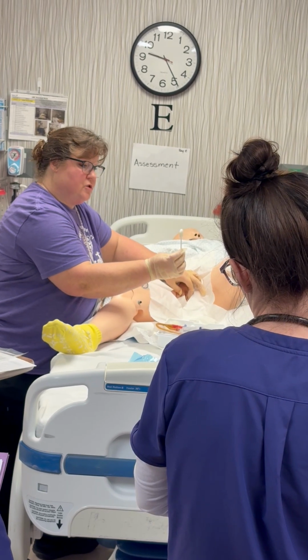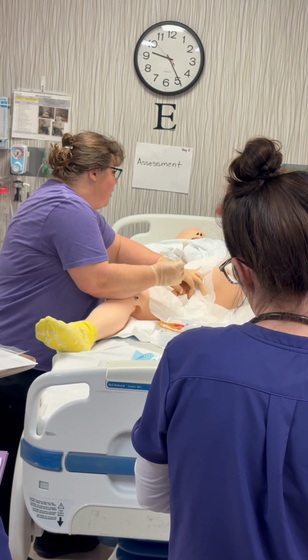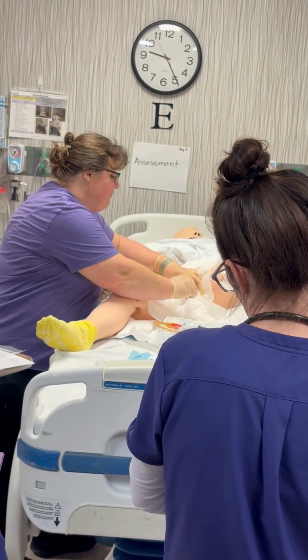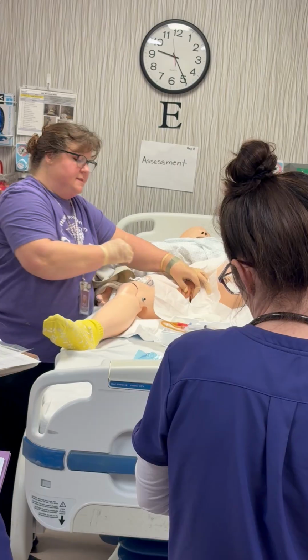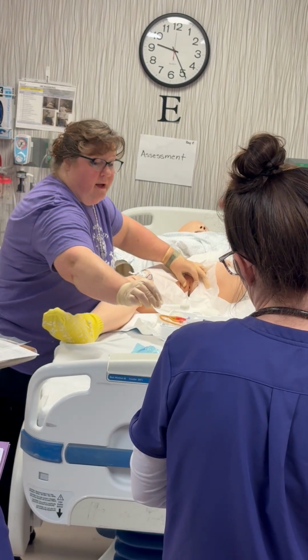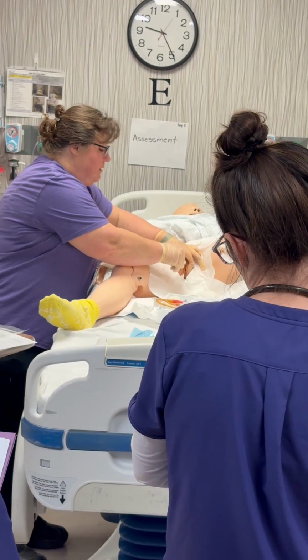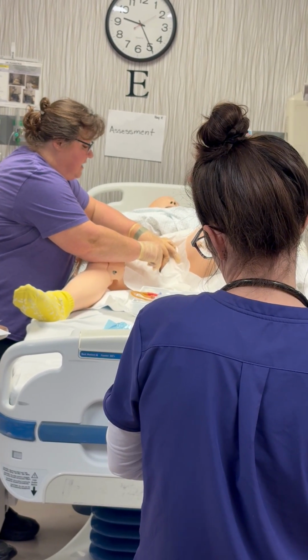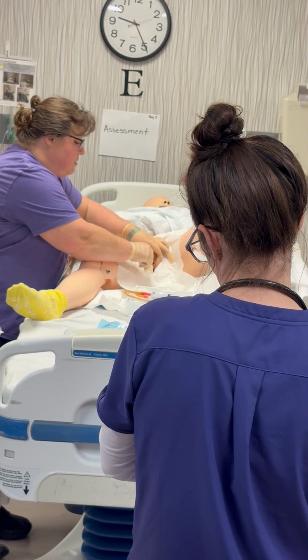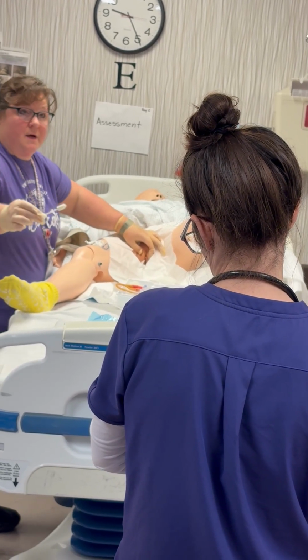So I take my first swab that's got betadine on it, and I'm gonna say, it's gonna be cold, and you're gonna wash away from you first, that labia all the way down, and then taking it out and dropping it. Your second one is towards you, okay? And it is on this side, and you have to keep this open the whole time, because you can't close it, because it will become non-sterile, okay?